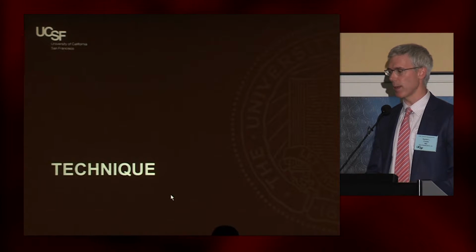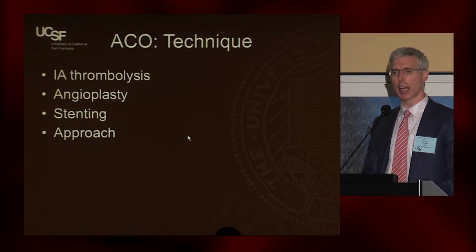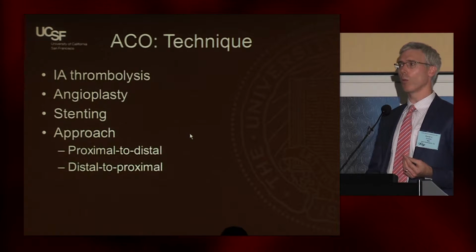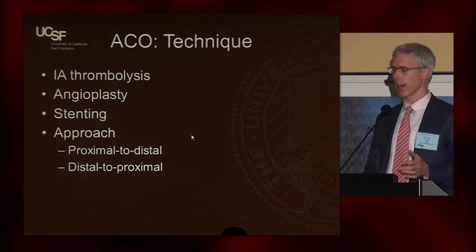So let's talk just a second about technique. I've already loosely referred to some of the methods. Obviously, there's IA thrombolysis, angioplasty, stenting, but just as important is the approach that you take, meaning what lesion are you going to address first? Are you going to do the neck first and then the head, or the head first and then the neck?